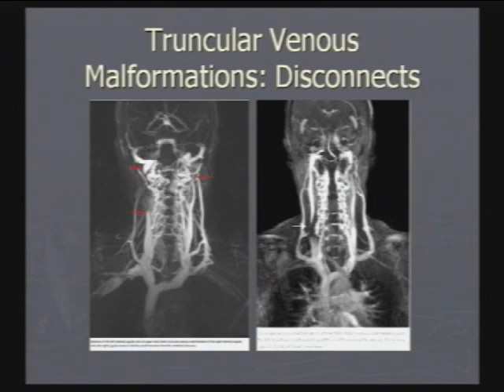Because as Sal was showing, if you have a membrane that's blocking the flow and you push the catheter through, you're going to open that membrane. If you have a narrowing there and you push the catheter up through it, it may not be quite as narrow as it was, at least in the images that I have. Or you may find that there is just no major vessel that continues to the sigmoid here.